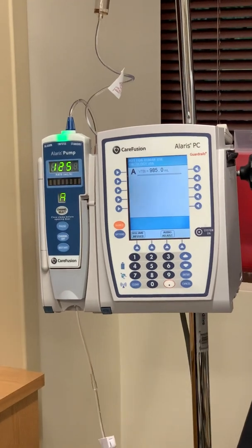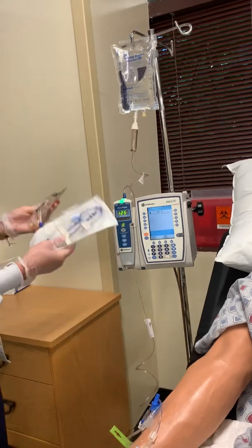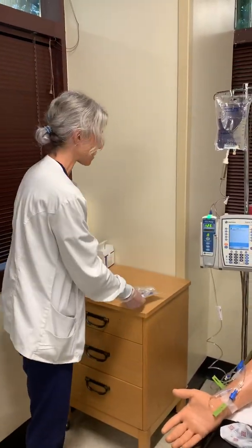So I'm making sure that all that's going, okay? So I've got my primary set up. The next thing we're gonna do is get our secondary set up, okay? So I'm gonna open my supplies. I'm gonna stay near the bedside.